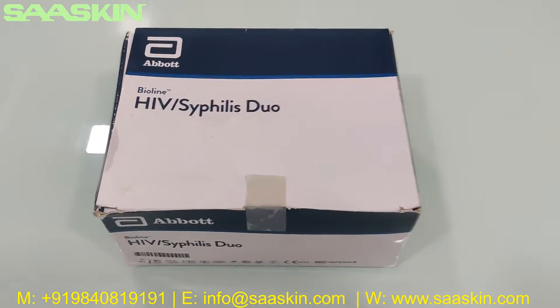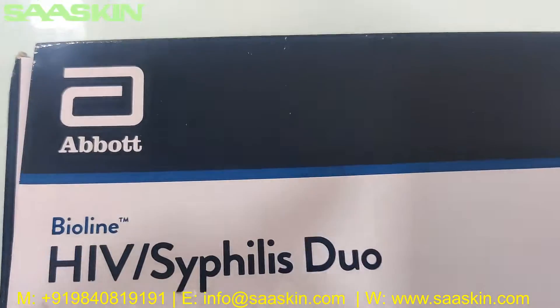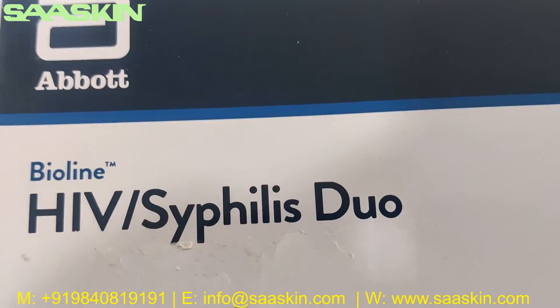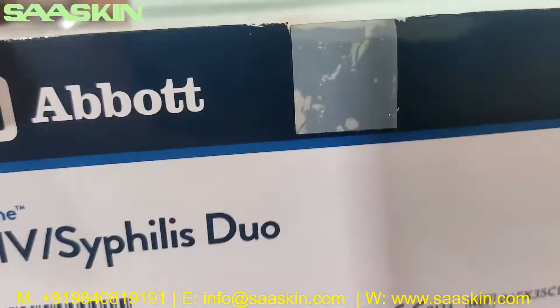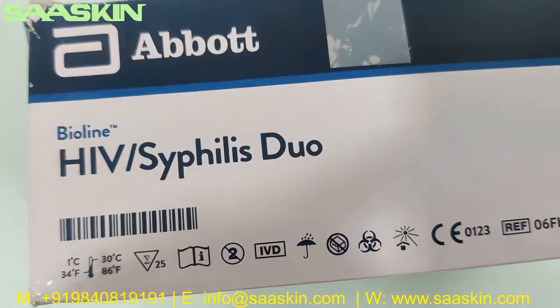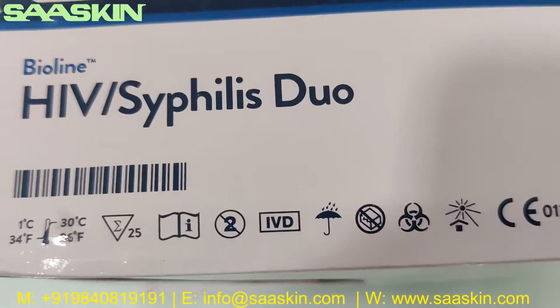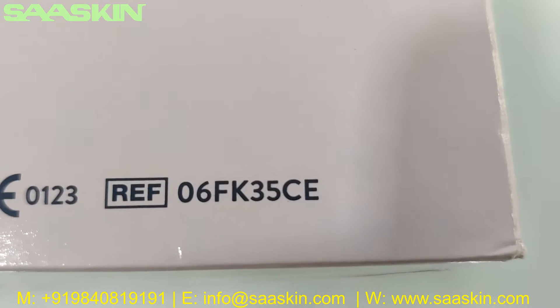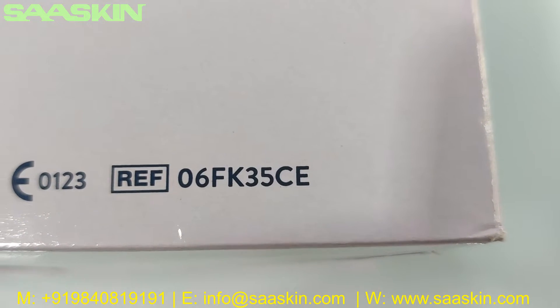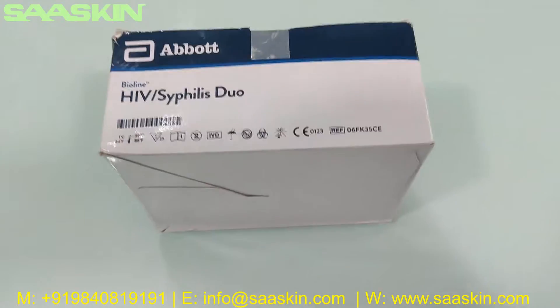This is how the box looks like — it says Abbott Bioline HIV Syphilis Duo Test Kit. This is a 25 test kit pack. You can see it is a certified product, and the reference part number is 06FK35CE.